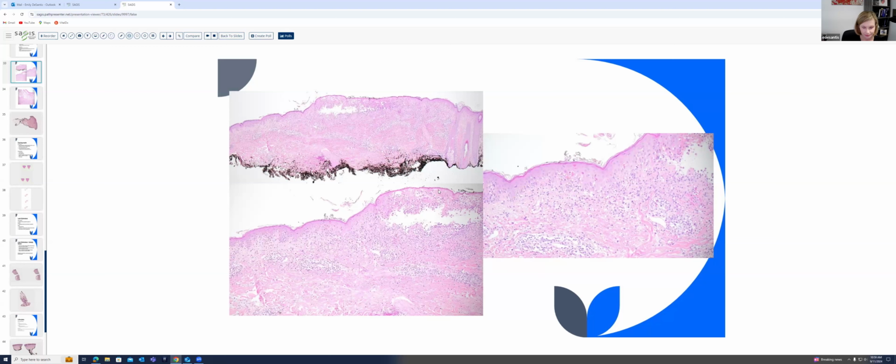There's some necrosis of the overlying epidermis. And on the right, at higher power, you see a lot of individual necrotic cells at all levels of the epidermis. So while we do have a vesicle, it's important to look adjacent to the vesicle to see what the true epidermal changes are. And in this case, we can appreciate that this is, in fact, an erythema multiforme reaction pattern that's actually forming a vesicle. So this is a bullous example of erythema multiforme.